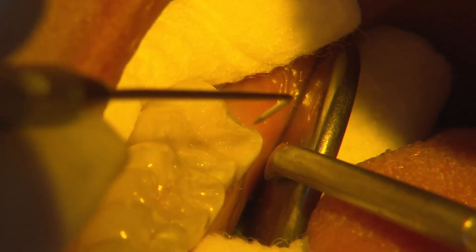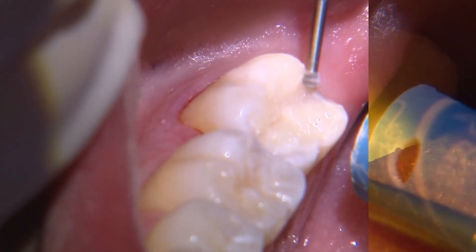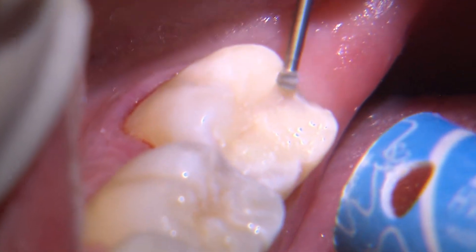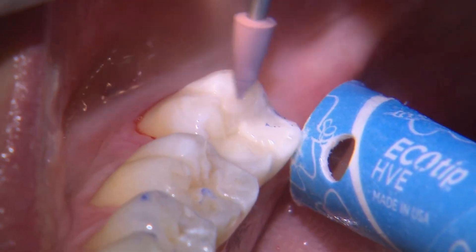I use an explorer to define the primary anatomy between each cusp's slope. With a slow-speed round burr, I remove any excess along the margins and adjust any high occlusal spots. I then finish with rubber-tip composite polishers to achieve a smooth surface.